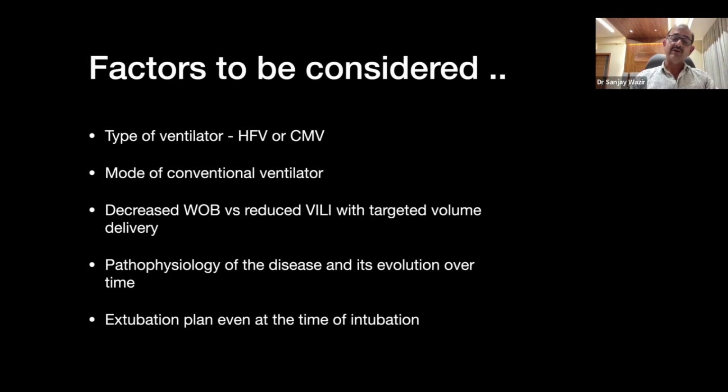We must always understand the pathophysiology of a disease, and more importantly its evolution over time. HMD on day 1 and HMD on day 4 are completely different diseases, and we must plan extubation even at the time of intubation, because we all understand the risk of putting a child on a ventilator.